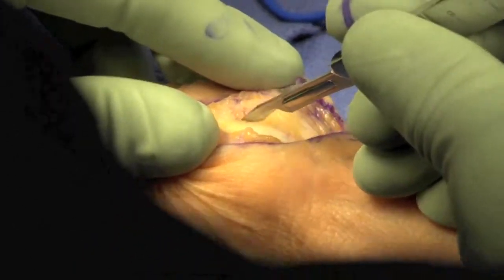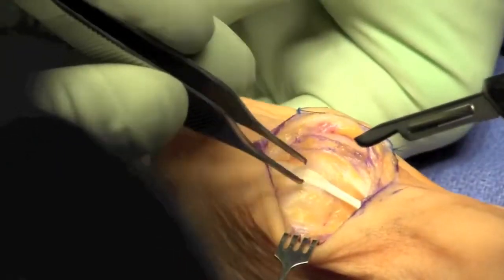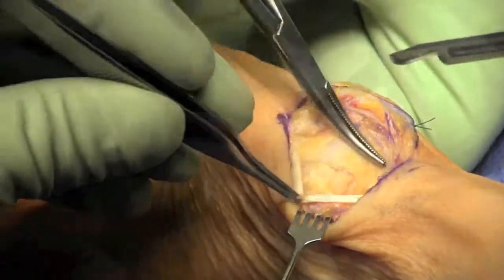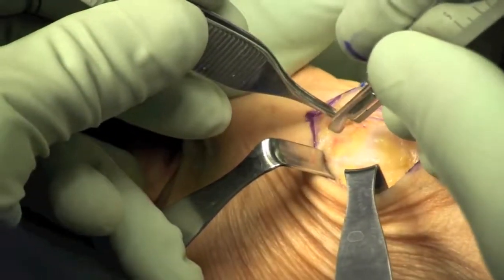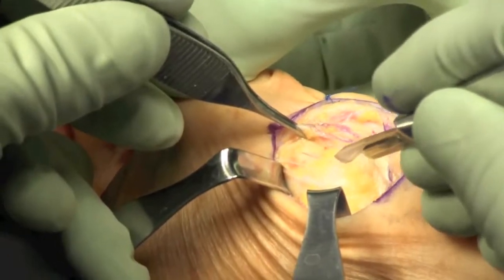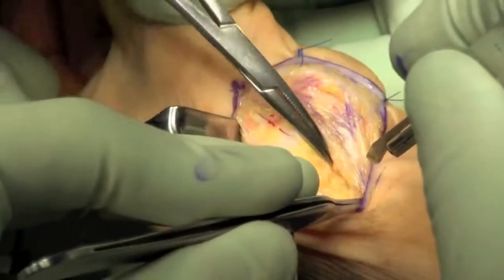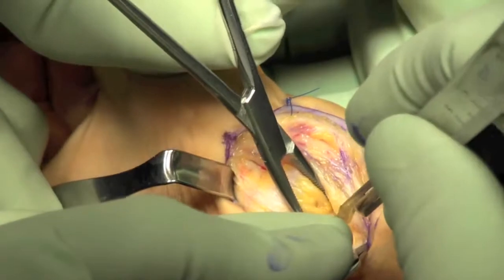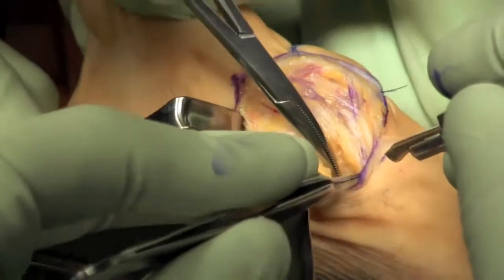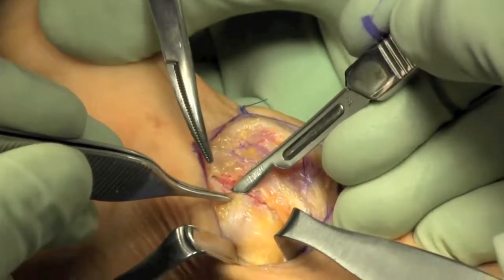Typically I prefer an H-flap. In this case we did a direct incision into the capsule overlying the trapezium. The deep branch of the radial artery was identified and kept out of harm's way with that proximal incision.